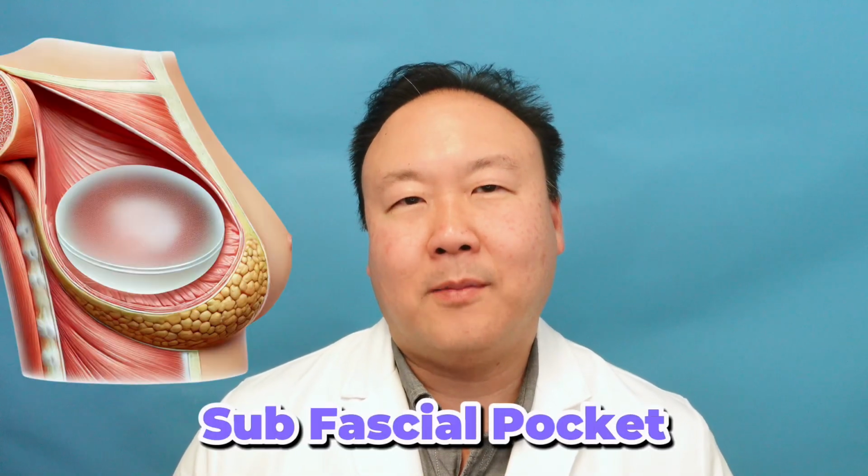There is a third option, a bit nerdy, but bear with me. It's called the subfascial pocket. In case you didn't know, muscle always has fascia, sort of this thin white, sometimes it's barely see-through, sometimes it's a thick white covering. And you see this if you eat meat. Well, the pectoralis muscle in the human has that thinnish, whitish, but still tough covering directly over the pectoralis.